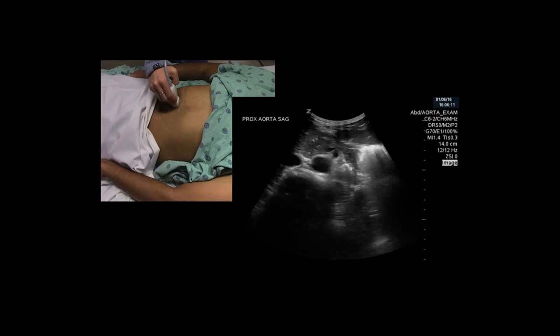If you direct your attention to the ultrasound image on the right, you can see an example of the image we are hoping to obtain. When you begin scanning the aorta, always make sure the depth on your screen is increased deep enough to locate the spine. This is the anatomical landmark we use to locate the aorta. You can see it labeled here. The spine will appear hyperechoic anteriorly with dark shadowing deep, as the sound waves do not travel through the dense bone.